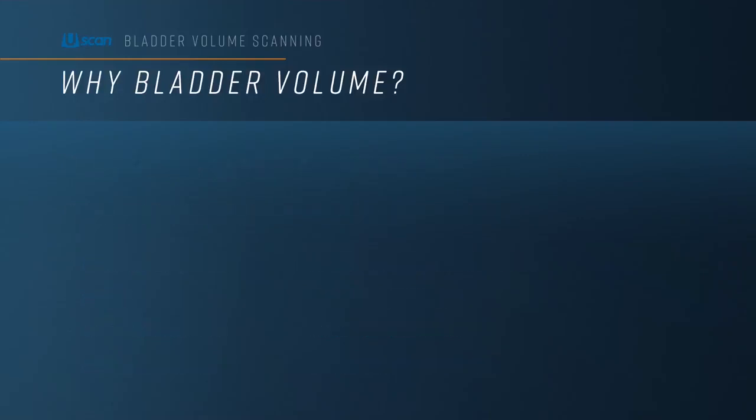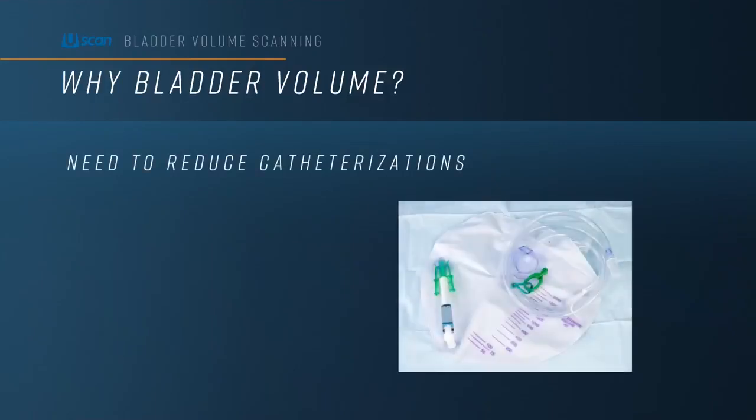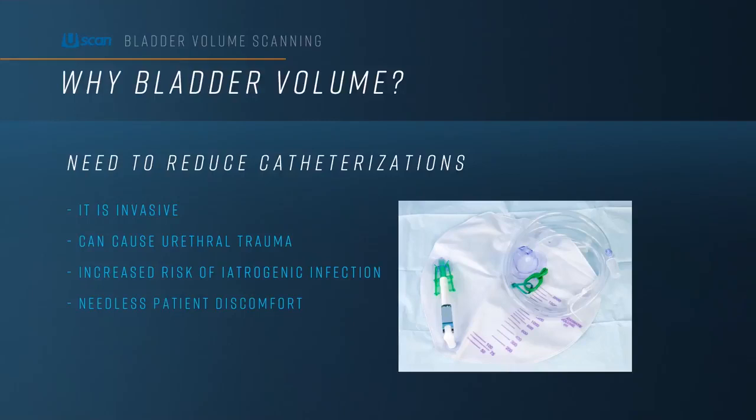Finally, one very important reason for bladder volume scanning is the need to reduce bladder catheterizations and the potential complications from repeated catheterization procedures. Catheterization is invasive, can cause trauma, and can lead to infections. In simple terms, catheterizations are uncomfortable for the patient and often unnecessary.